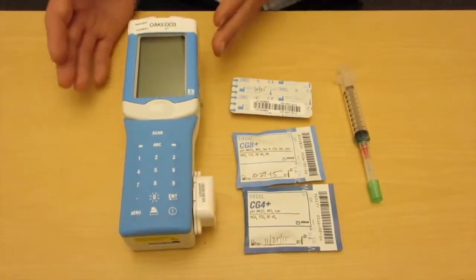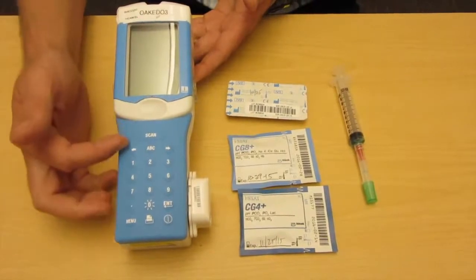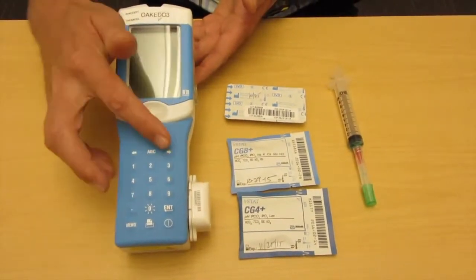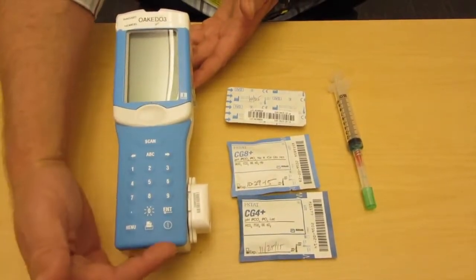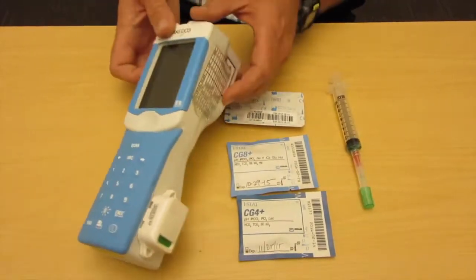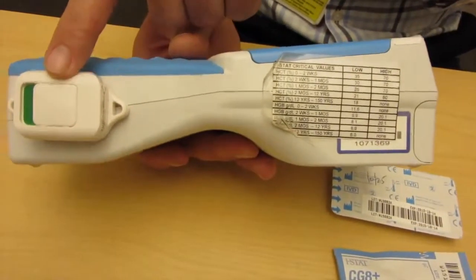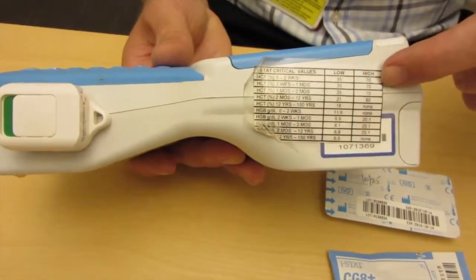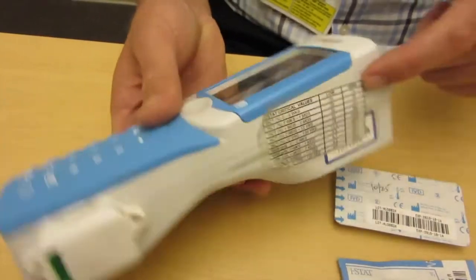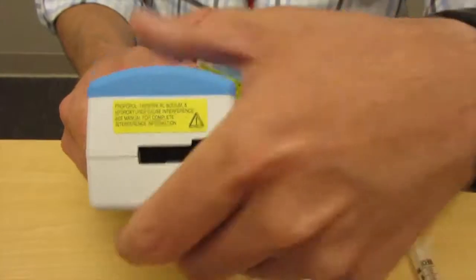In terms of orientation to the iStat itself, there are a couple of things to know. On the front face, we've got a variety of keys: scan key, forward and backwards arrows, power button, print button, and menu button. On the side we have an AwarePoint, which allows us to track where our iStats are if we can't find one. We also have our critical lab values listed there, and at the bottom we have our cartridge port where we put our CG4, CG8, or troponin cartridges in.